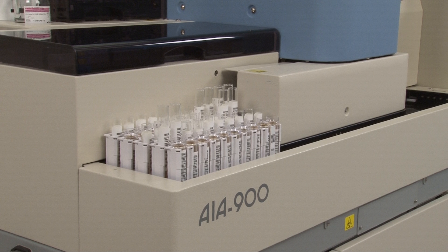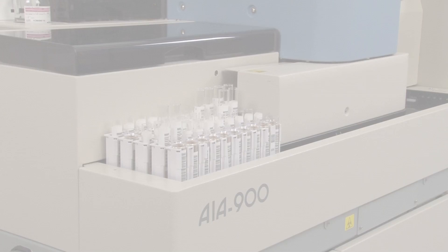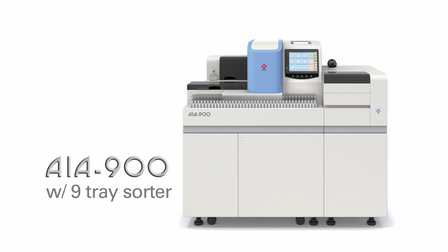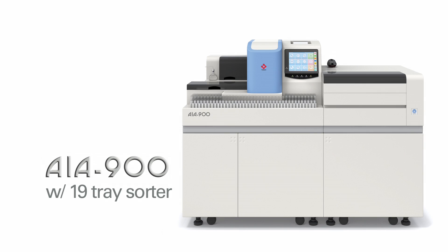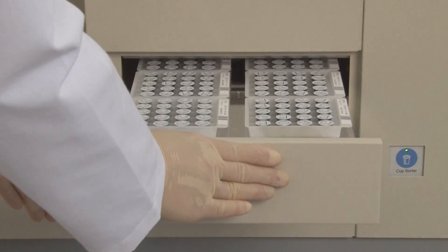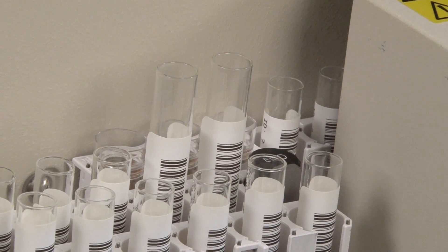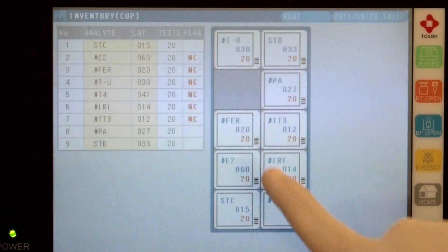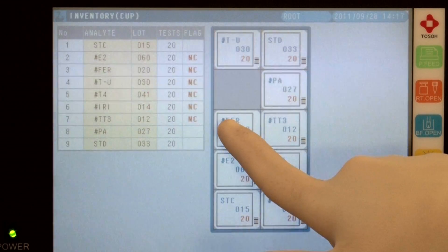For larger volumes or more automation, the AIA 900 can be equipped with an optional 9 or 19 tray reagent tray sorter. Once the reagent tray is loaded in the reagent drawer, the barcodes on the trays and sample cups are read and the inventory is stored in memory for easy review by the operator.